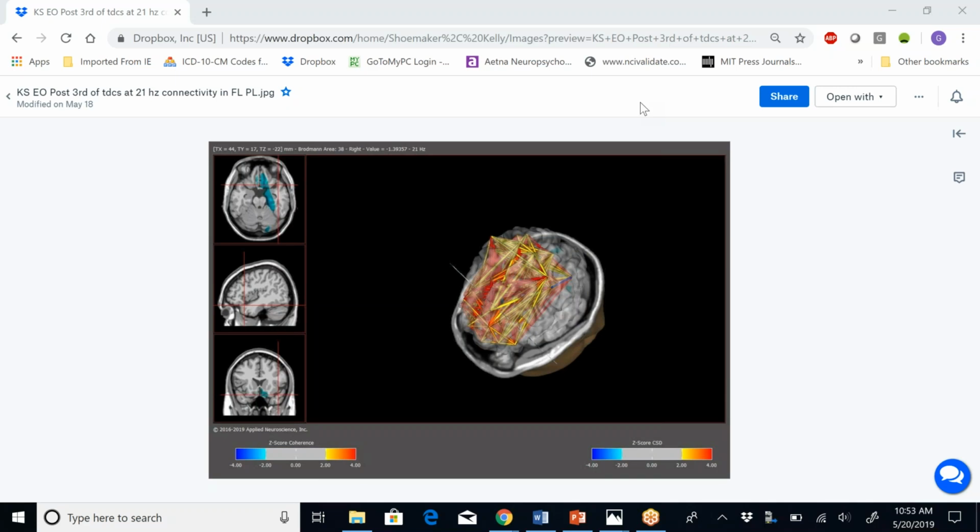So there's another treatment protocol, same type of stuff we're talking about with functional testing and imaging, but it's over the language areas and trying to enhance language production. So that's another protocol that we've got going on that we're studying in autism. So there's the executive, there's the language, and then the third one is the social pragmatics.